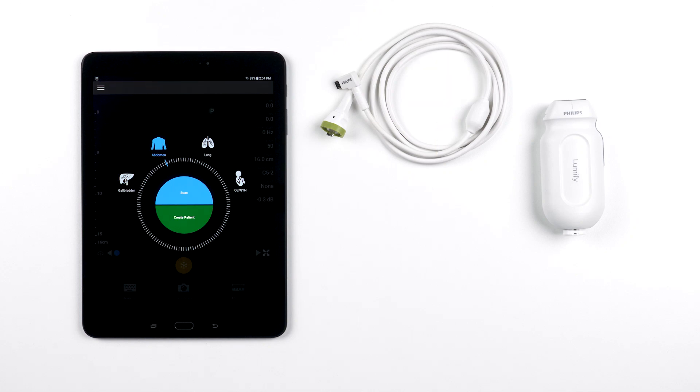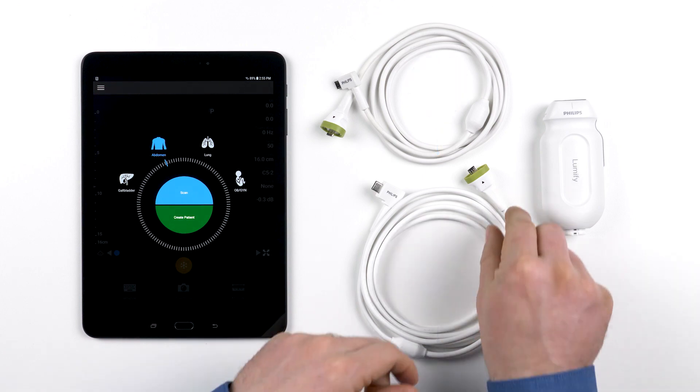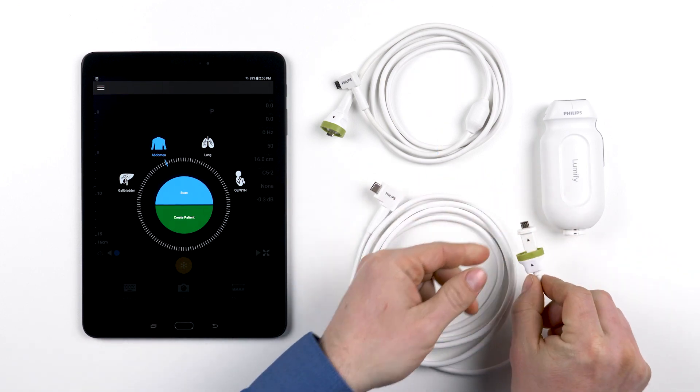Because as tablet technology changes over the years, we want to be able to keep up with it. For instance, when mobile devices moved from Micro B to USB-C, it was a simple update for Lumify users. They got a new cable from Philips, disconnected the old Micro B cable, and attached a new USB-C cable.